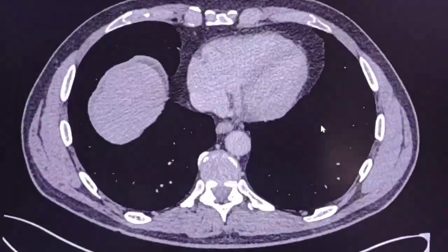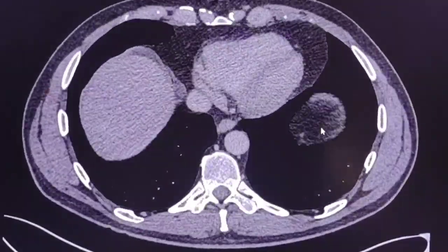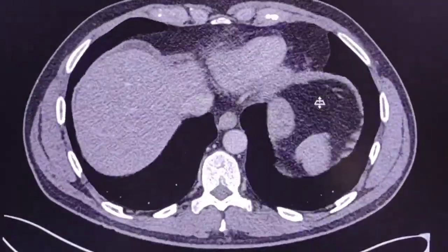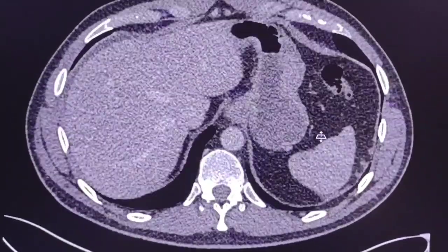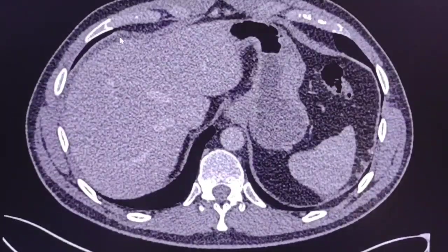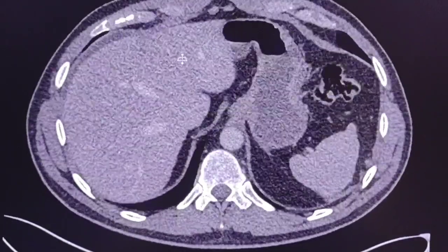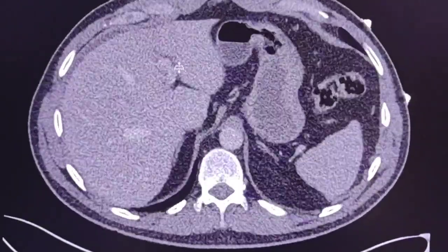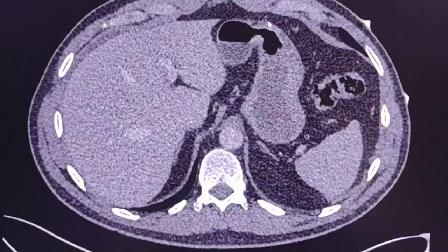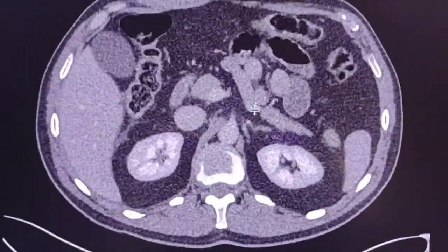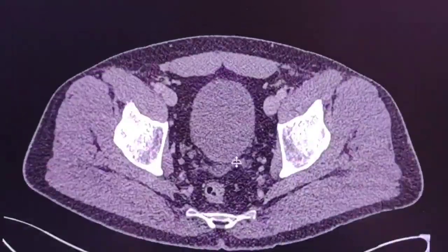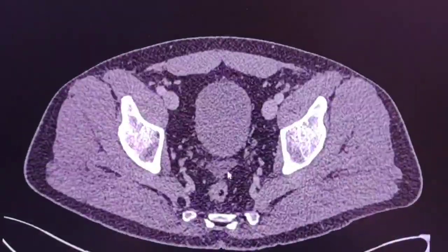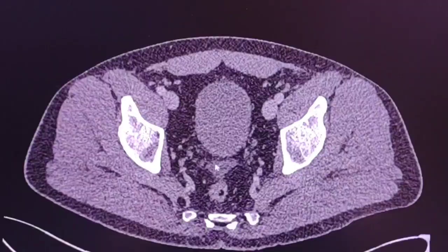Here are the images. Going straight to the findings: there is some reactive free fluid in the abdomen and in the lower abdomen as well.